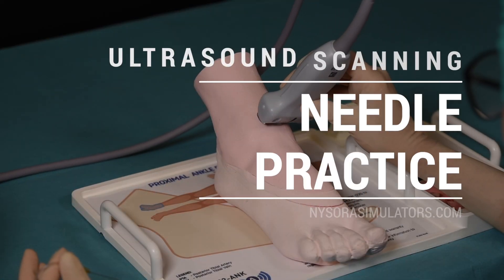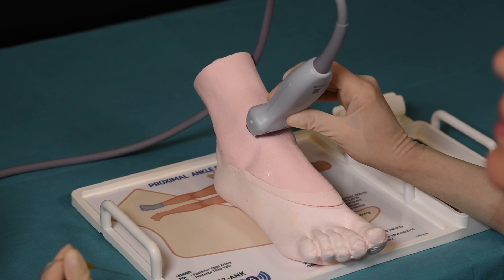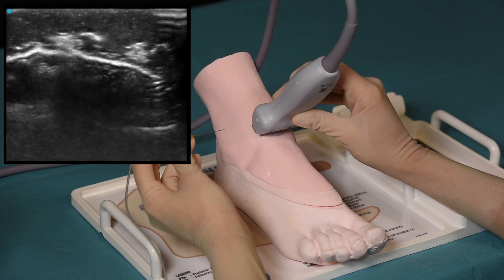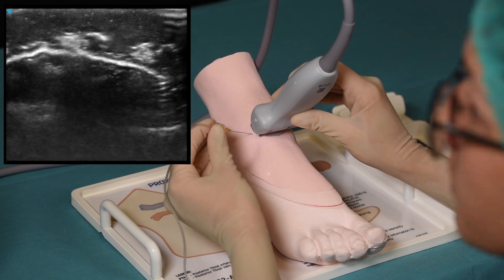Let's begin practicing using the Nysora simulator. With the transducer positioned between the medial and lateral malleolus, the ultrasound image shows the cortex of the tibia and dorsalis pedis artery, with the deep peroneal nerve positioned immediately lateral and slightly superficial to it.